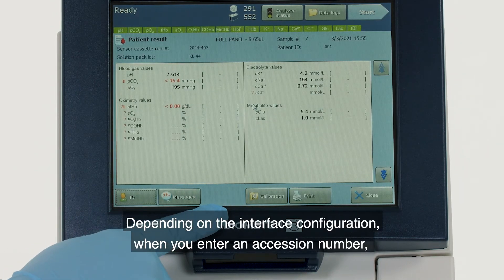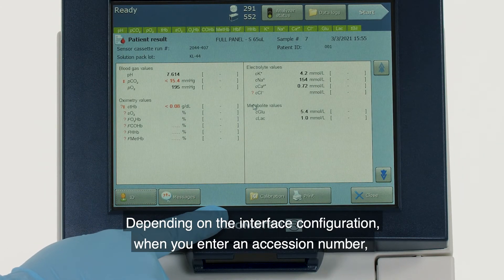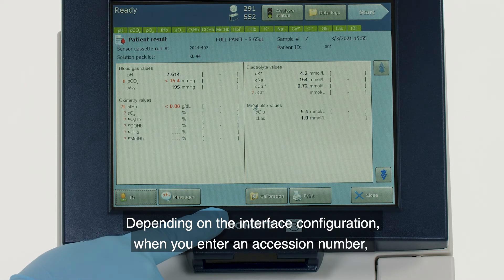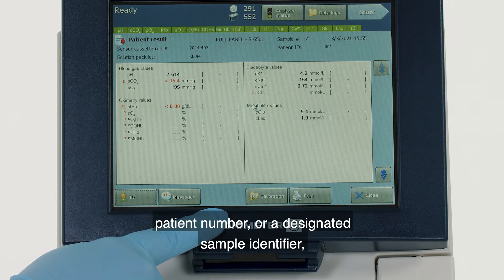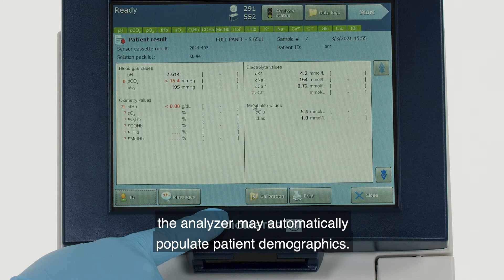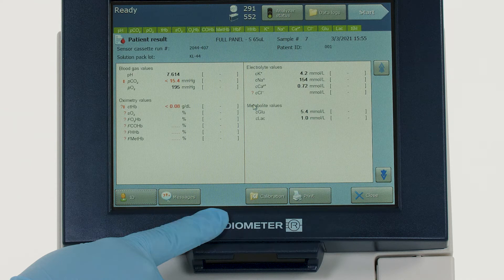Depending on the interface configuration, when you enter an accession number, patient number, or a designated sample identifier, the analyzer may automatically populate patient demographics.